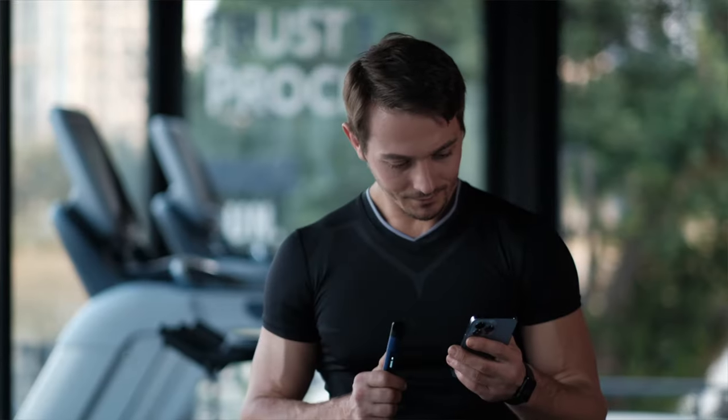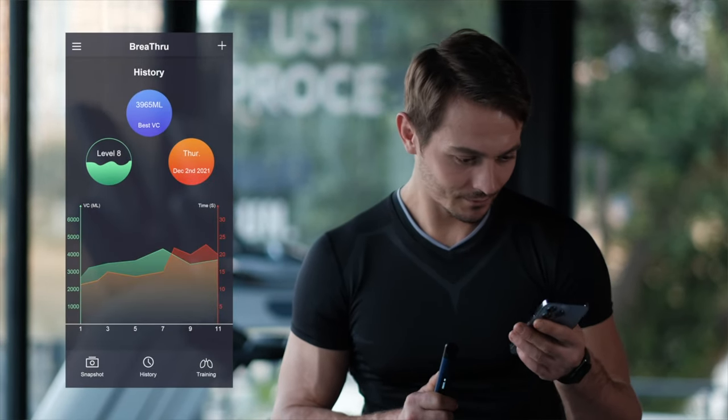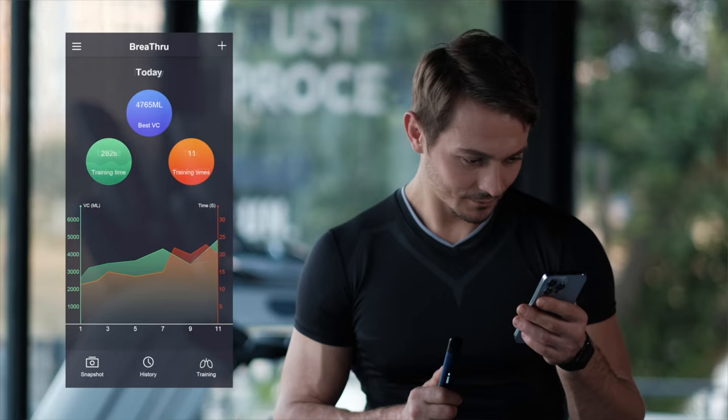Now, while this device is probably not for everybody — there's probably not a ton of people thinking they need to get their lungs tested on a regular basis — at about $40 US on Kickstarter right now, this device is a pre-production one. The final version is actually going to have a companion app that will allow you to get even more insights into your breathing and your lung health and all that great data.